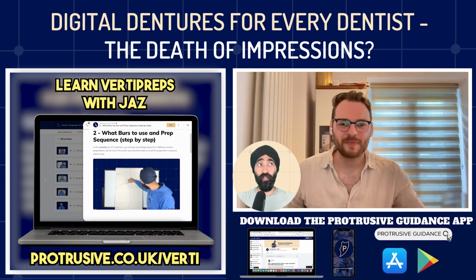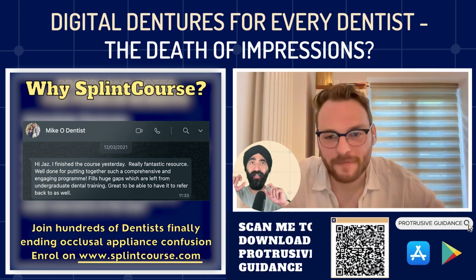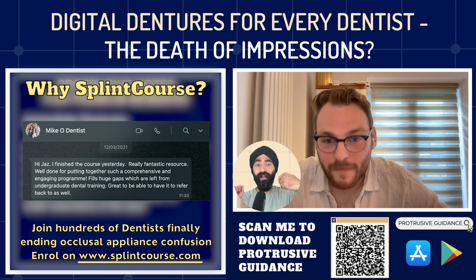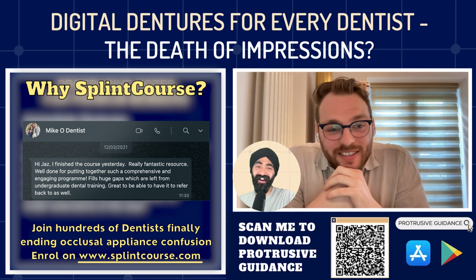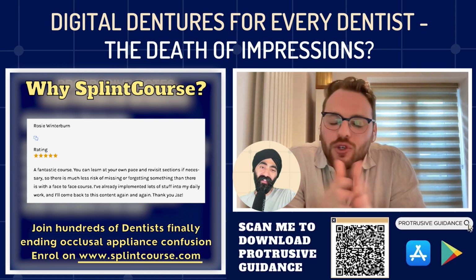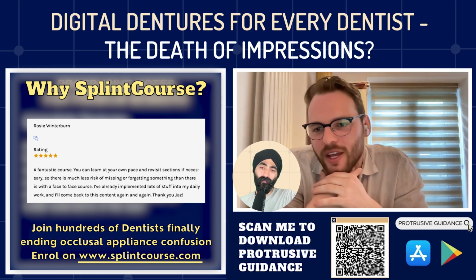So what you're saying is, you actually tried to bypass impressions completely and did it all from scanning, and I imagine you're holding the cheek in a certain way to mimic where you imagine their border molding would be, right? Is that what you're trying to do? We just scanned it, and Dean just guessed as much as he could. Okay. But yeah, so you can get a bit of under-extension, but if we're talking immediates, you're relining them at 3 months, you're remaking them, so it's not the end of the world.